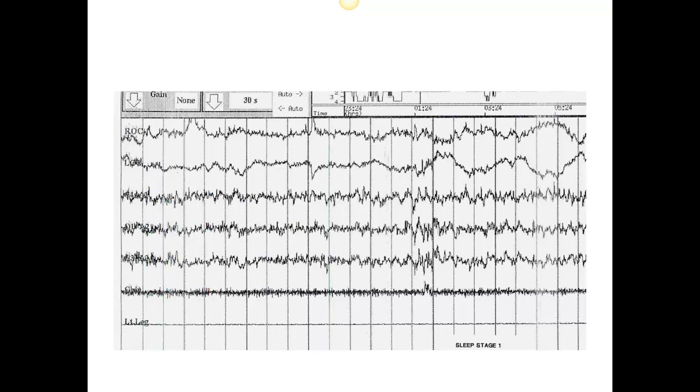Generally what we look for in stage one is a slowing of the background frequency, and the cycles per second drops to maybe 4 to 7 hertz or cycles per second, and the presence of those slow rolling eye movements.